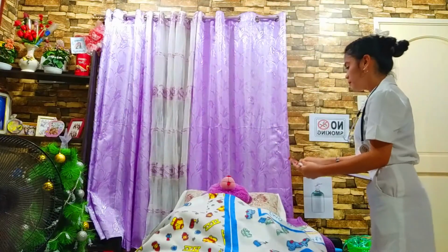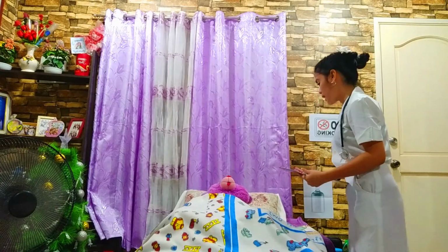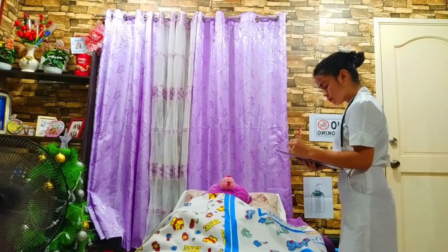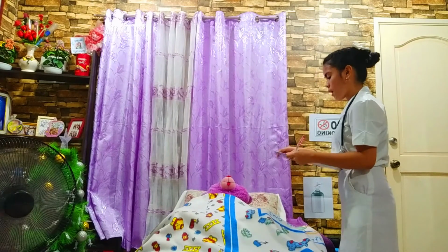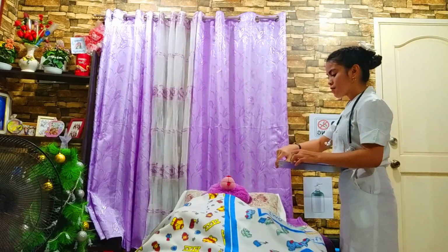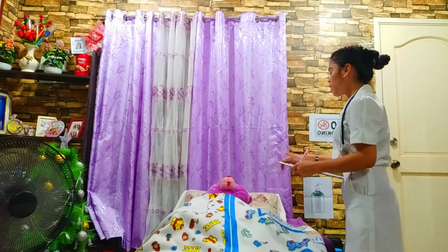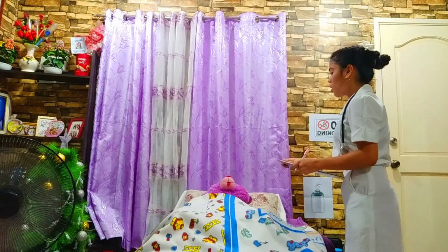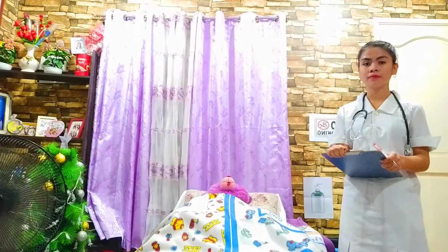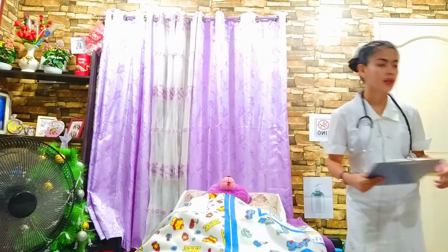And then for implementing, first we need to identify the client. Good day, ma'am. I am Ian Grace Mayorga, your student nurse for today po. So what's your name po? Okay, kailan po ang birthday niyo? Okay, so today po ma'am, we are going to administer the oxygen via nasal cannula and also via simple oxygen mask to provide you po a moderate oxygen support po. Would that be okay with you po? Okay.